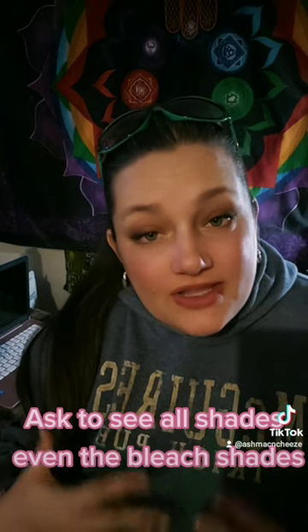So here are a few tips whenever you're trying to decide on what shade to go with. Don't look at all of the shades at once. Cover up the other shades and look at them each individually. Also consider the lighting in the room and how they would look outside in natural light. Typically, as a general rule, you don't want to go whiter than the whites of your eyes, but of course that's a personal choice. Also, some dentists don't even show their patients the BL shades.